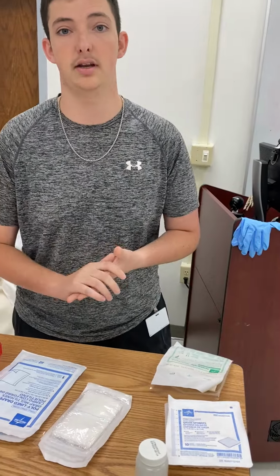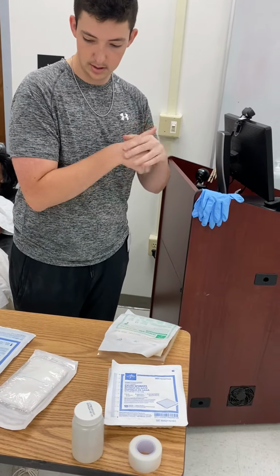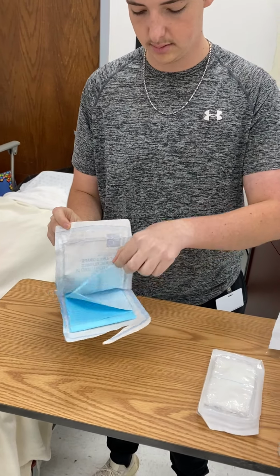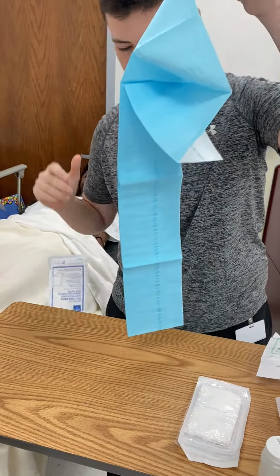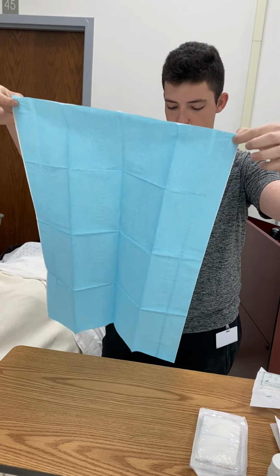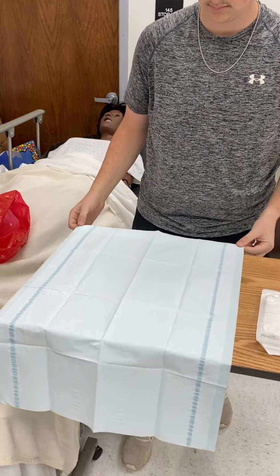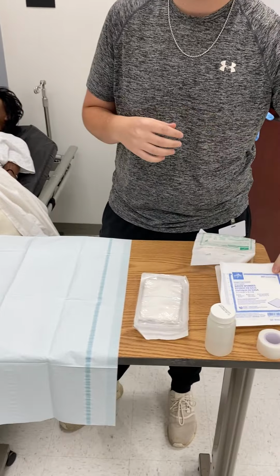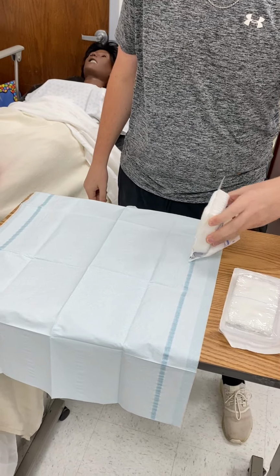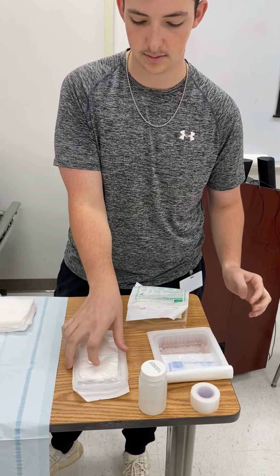Perfect. Okay, everything is in date and not contaminated. Now I will begin to prep my sterile field. I'm going to perform hand hygiene before I begin. All right, now we will maintain sterility. Okay. Placing our gauze. I'm going to keep this folded down because we'll be using this later for the water.